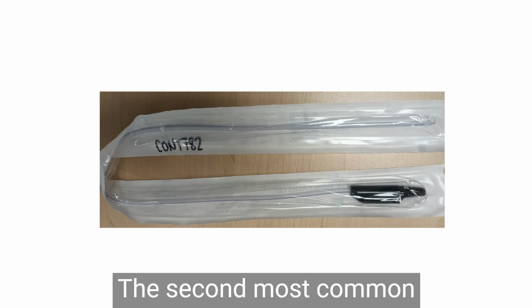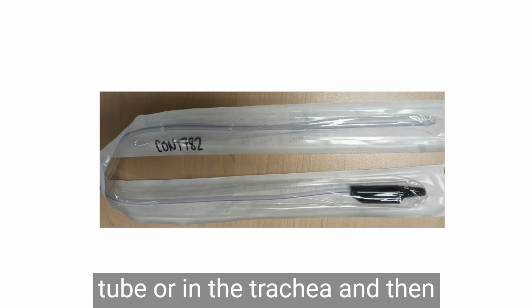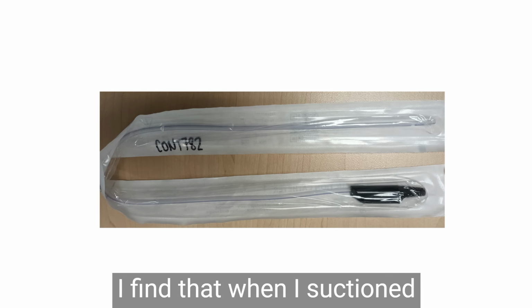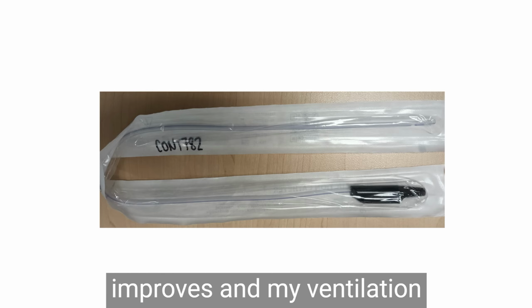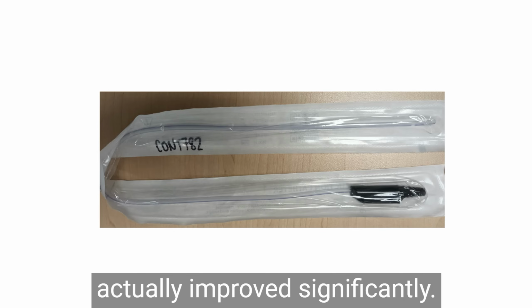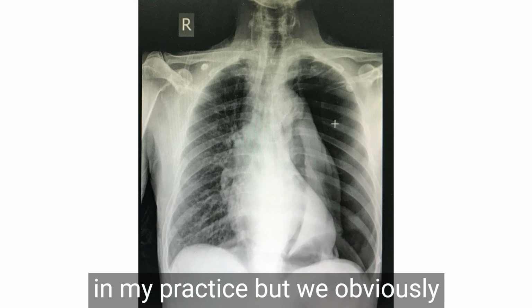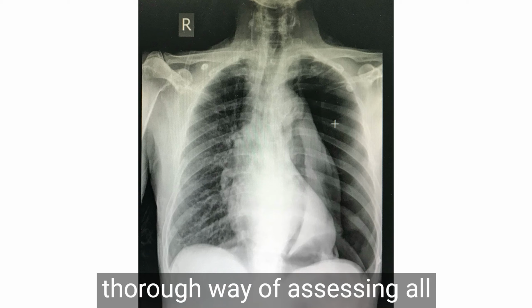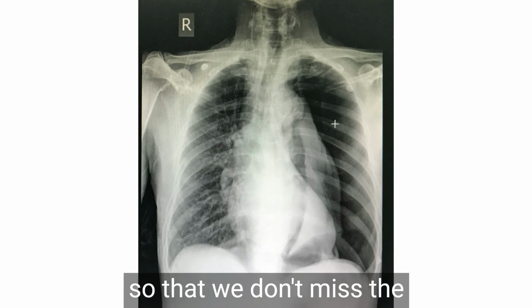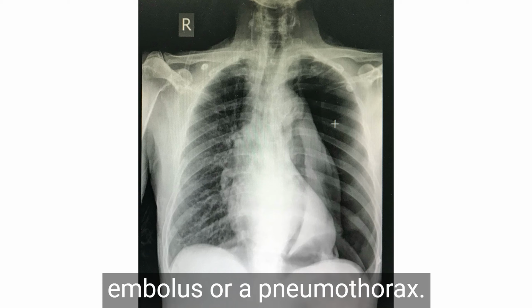The second most common cause of hypoxemia is probably secretions down the endotracheal tube or in the trachea. And then I find that when I suction these out with a soft suction catheter, the oxygenation improves and my ventilation actually improves significantly. So those are the two most common causes of hypoxemia in my practice, but we obviously need to have a systematic, thorough way of assessing all potential causes of hypoxemia so that we don't miss the rarer causes of hypoxemia, such as a pulmonary embolus or a pneumothorax.